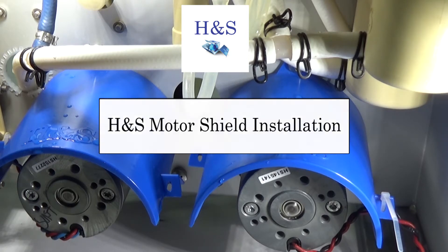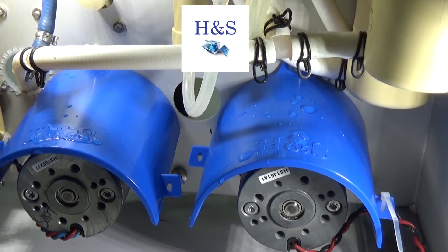At HNS, we are always developing new and innovative products for the dialysis community. We are proud to showcase one of our exclusive products, the HNS Motor Shield.